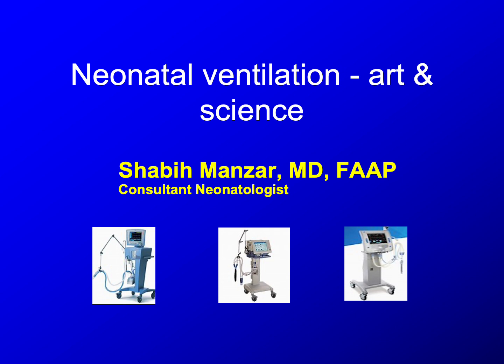So of course, as the first slide, this is the introduction slide, and it's very evident here, as you guys can see, that there are different ventilators you can use, depending upon your hospital policy, but basically the principle honestly remains the same, especially when we are talking about conventional ventilators. There are different types of ventilators, as you guys know: conventional ventilation in neonates and high frequency ventilation, and there are two types of high frequency ventilation. One is jet and the other one is oscillator, and that is another talk. We're not going to cover the jet ventilator here. So let's proceed and see where we are.